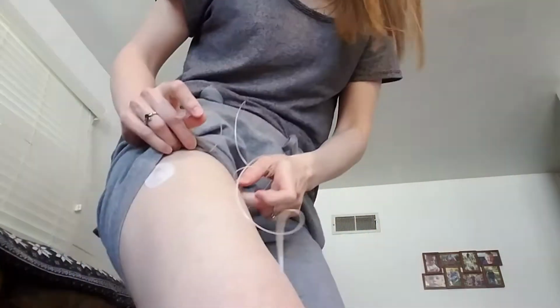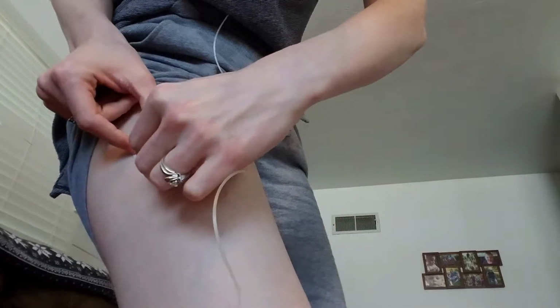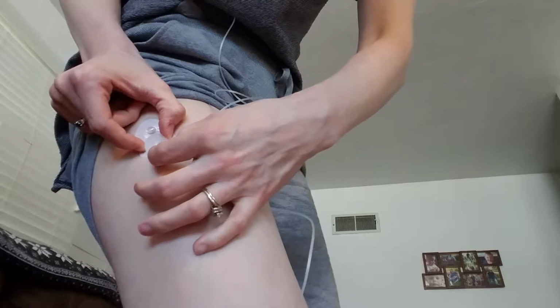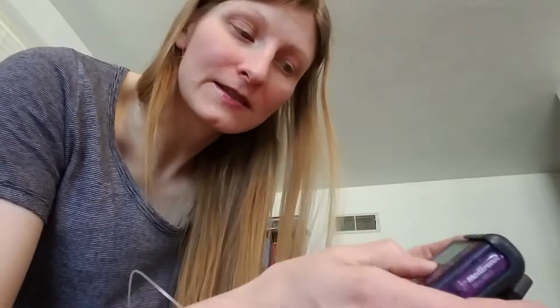And I'll go ahead and show. This is my cannula, my infusion site. I have to plug this in on the bottom. Yep. There's only one direction that it goes, so I have to turn it over to find the right way. Okay, so that's in there now. Tubing up. Okay, now I need to escape because I'm done. Yes, I see droplets at the end. I have to answer all these questions.